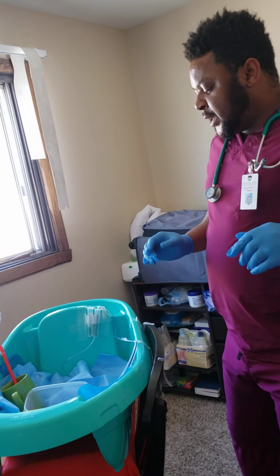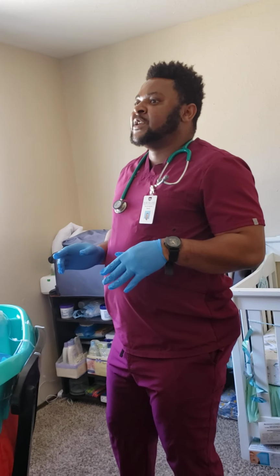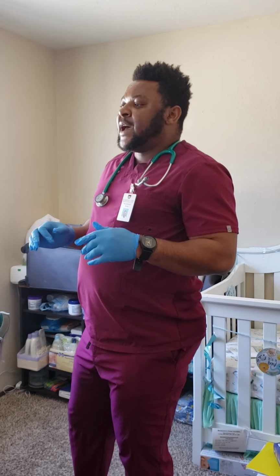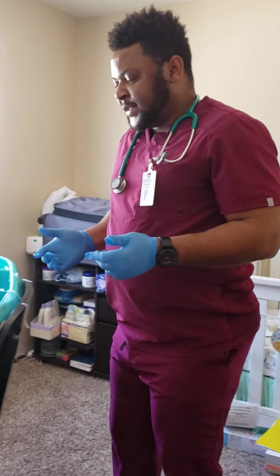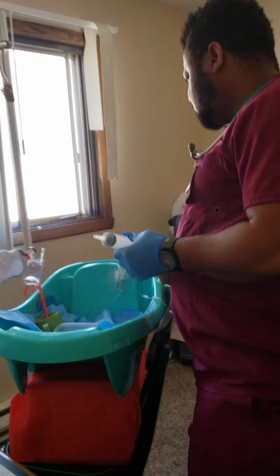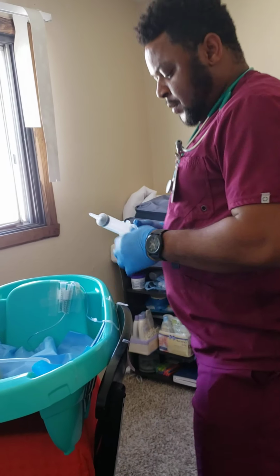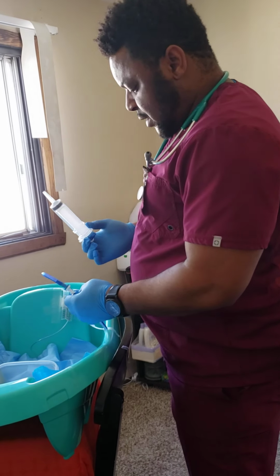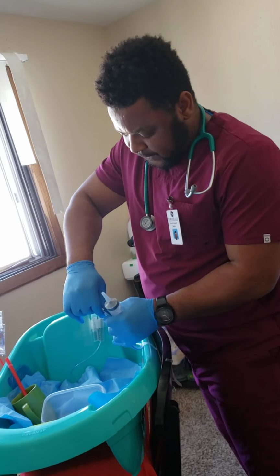Okay, after doing that, I want to send the patient down for placement confirmation, and the best means for placement is by x-ray. Either I send the patient for x-ray, or I can also do a test using my piston syringe, take out an aspirate, and then test it with my pH strip.